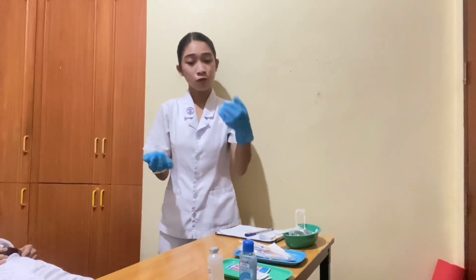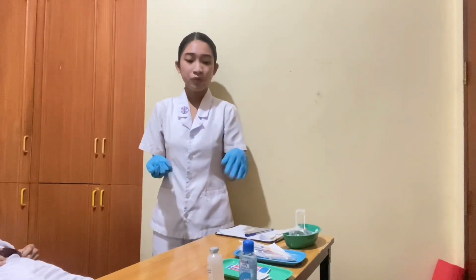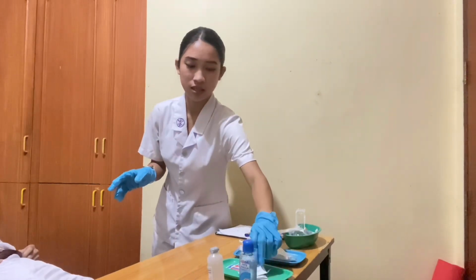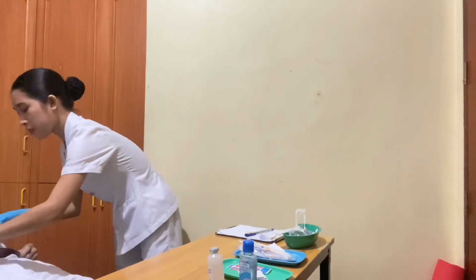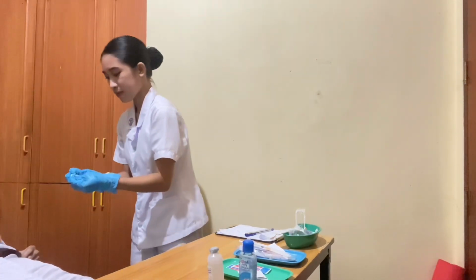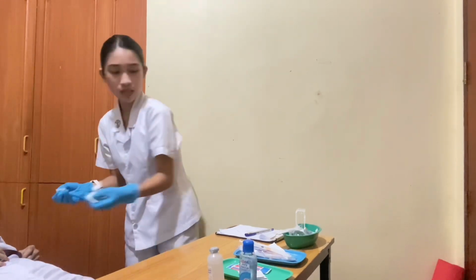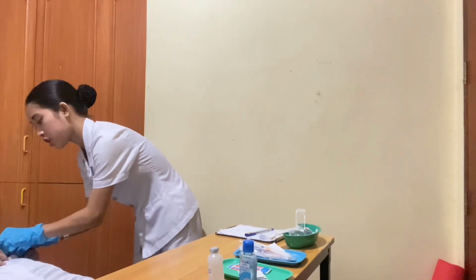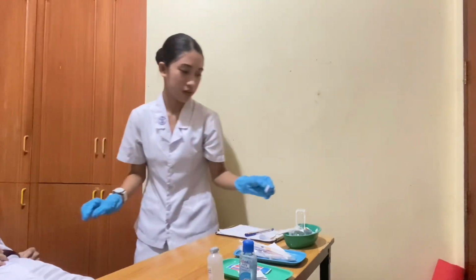Again, I'm going to perform hand hygiene and apply gloves. I am done doing it. I'm going to clean now this side. I'm going to inject here in your area, ma'am, since there are no signs of lesions. In a circular manner.